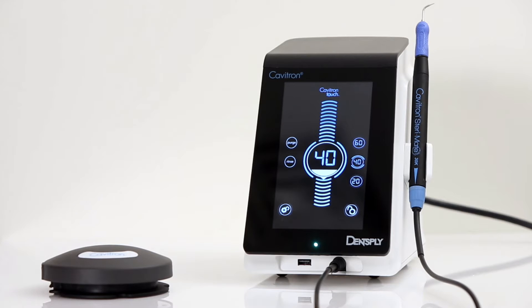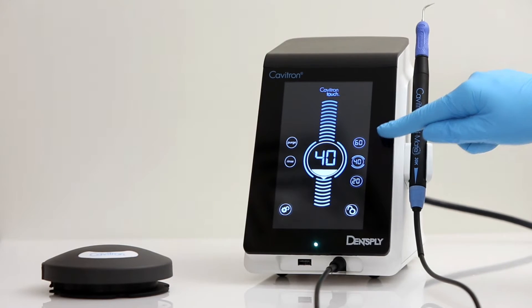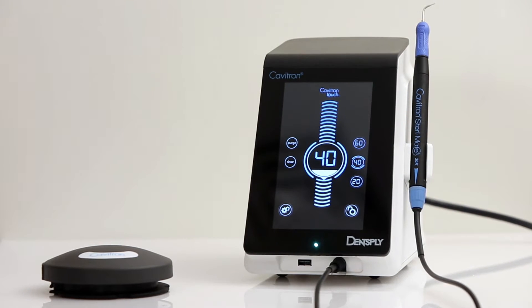The right side of the screen contains 3 preset power settings that come factory set to 20, 40, and 60. However, these can be reset to any level desired.